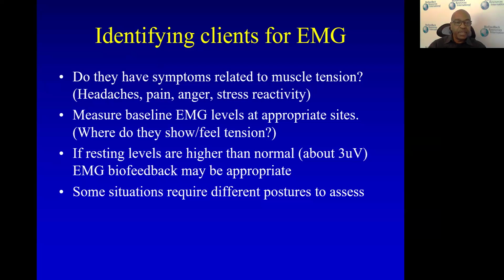Measure baseline EMG levels at appropriate sites. So where does a person feel tension? And if their resting levels are higher than about 3 microvolts, then EMG biofeedback might be appropriate.